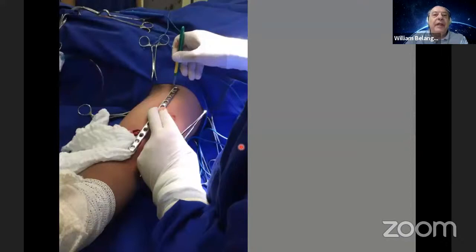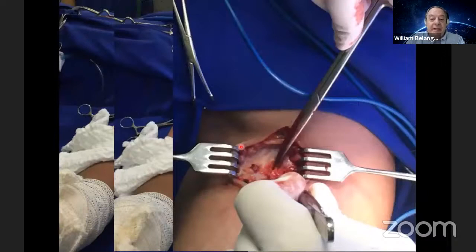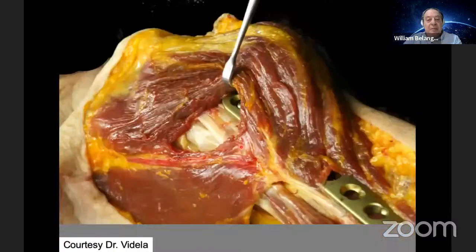Then I go to the proximal approach. It's a very easy approach. You see, between the pectoralis and the deltoid. You see the biceps. This is the anatomical cadaveric specimen. You see here the long head of the biceps. This is the relationship between the plate and the biceps. This is the pectoralis. This is the deltoid. This is the window that I use to introduce the plate.